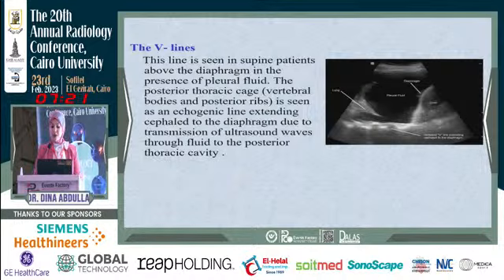The technique of chest ultrasound. Examination of a seated patient with a linear probe placed longitudinal on the right parasternal line. We can see cartilage at the point of insertion of the rib, intercostal space, intercostal muscle, and the pleural line. Examination of a seated patient with a linear probe placed parallel to the ribs. In the third intercostal space, for example, we will see intercostal muscle and the line of the pleura.